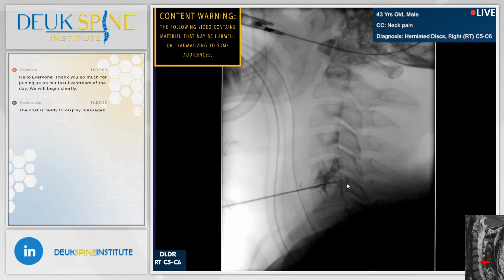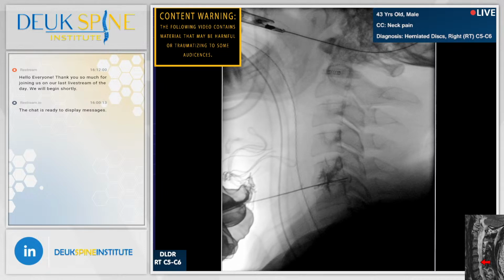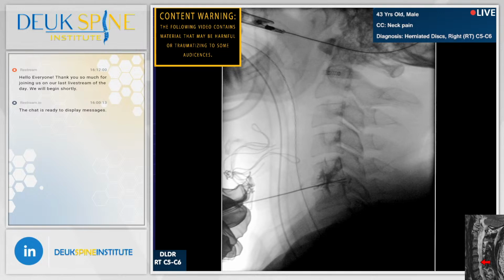Yes. All right. I've just made my 4mm incision. Now we're going to take the needle out. We're going to bring the dilator in. While I'm doing this, I have to hold the guide wire in position. Shot. Got to check the guide wire, make sure it's not moving in any further. Shot. Okay, it's in perfect position right now. So far we've lost 2 drops of blood. This is a bloodless surgery.